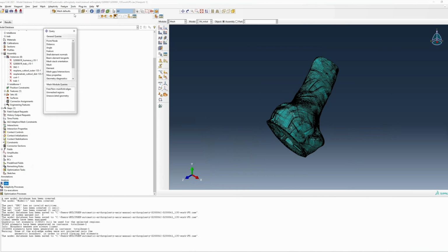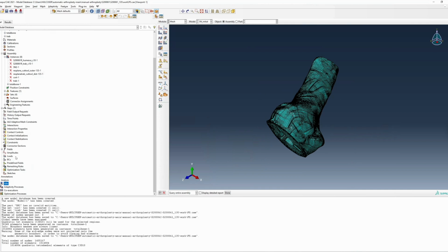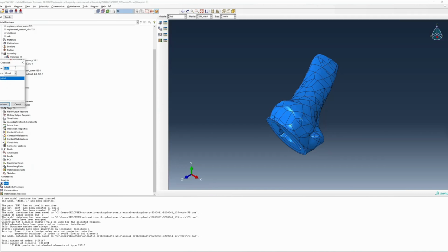Before progressing, please query your mesh and just validate that you have a good mesh. After this step, you're kind of stuck with the mesh that you have, so please ensure it's mesh that you want before continuing. The next step in our analysis is to create a job and write your input file to your working directory. This process will allow us to create an orphan mesh, which we will then use for our material property assignment.